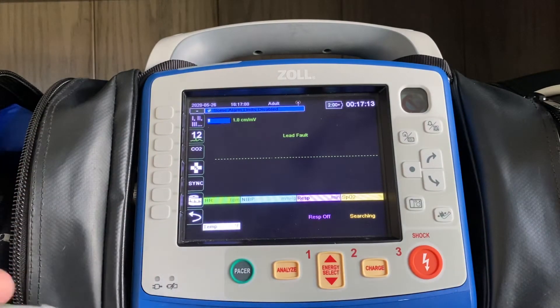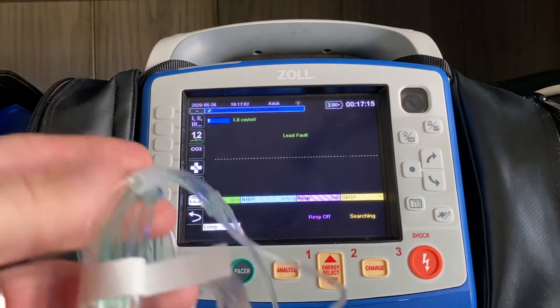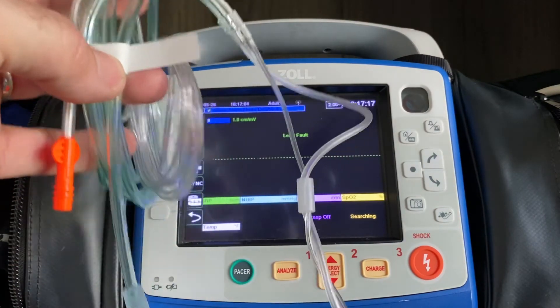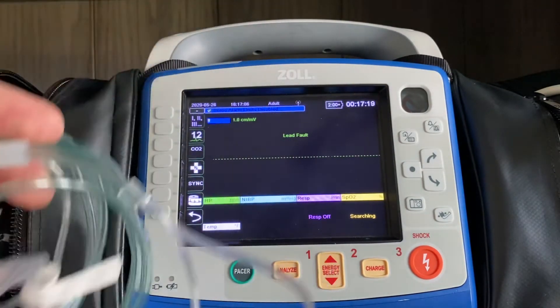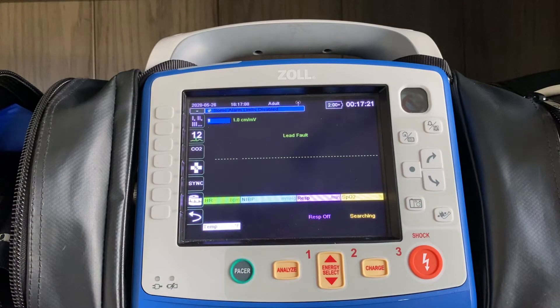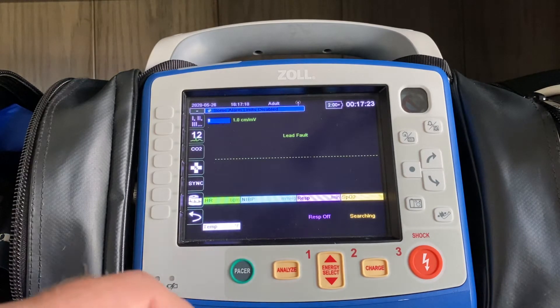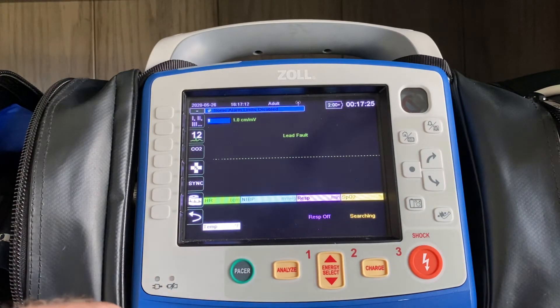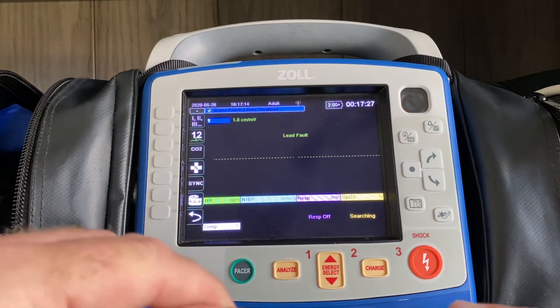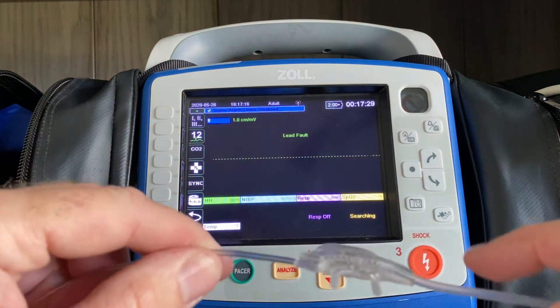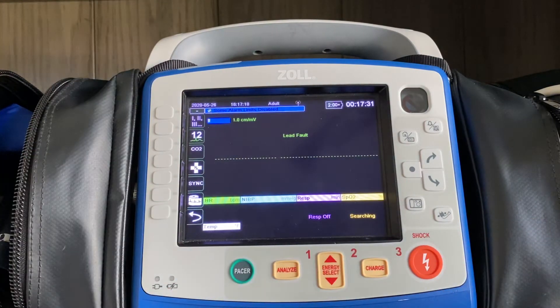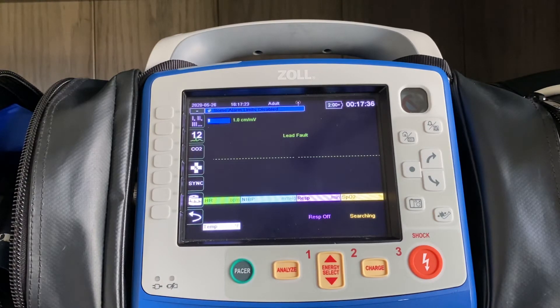The disposables that have supplemental oxygen will include this green tube set, which can be plugged into your oxygen port. When providing oxygen in that way, rather than just driving it into the patient's nostril, it's going to push the oxygen through these little pinholes. That develops a cloud of oxygen around their mouth and nose, which clinically speaking is a more effective way of delivering oxygen to that patient, because if they're breathing heavily out of their nose or mouth, you're going to provide oxygen to them either way.